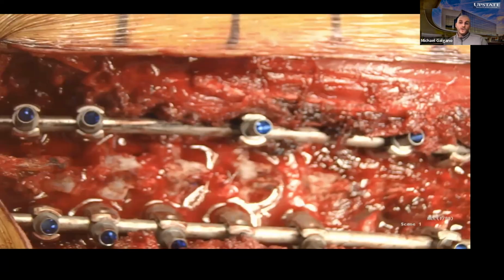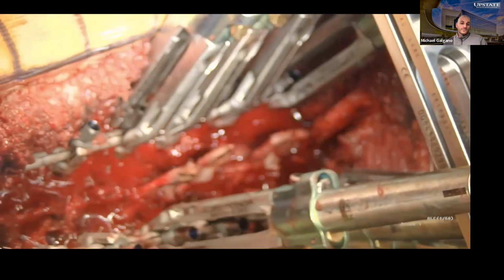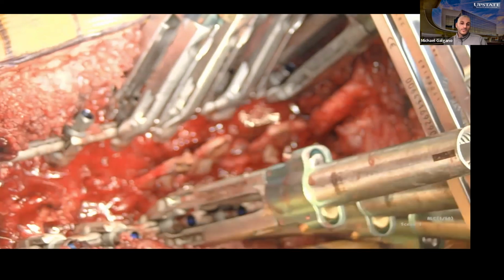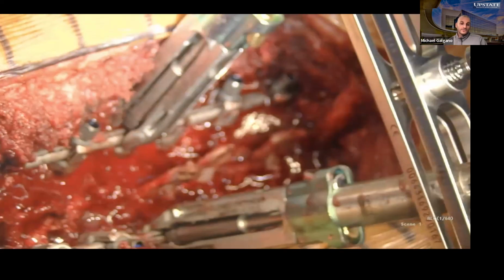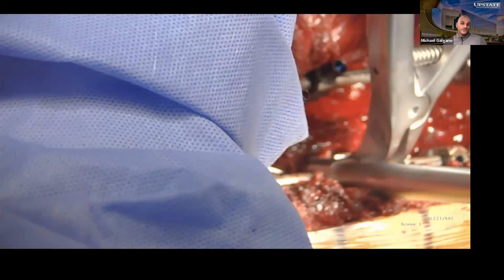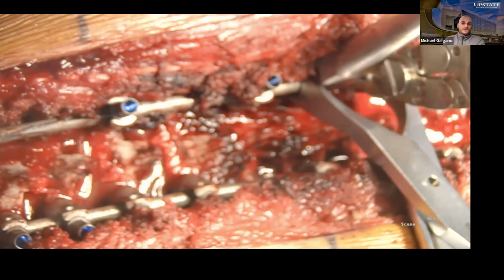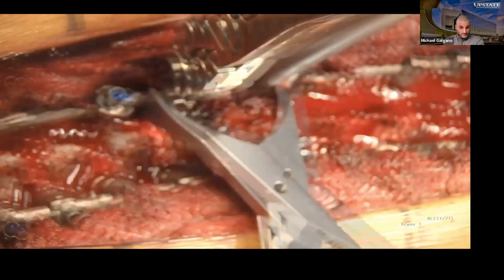And then after you do that, it's all about fine tuning, right? You put your derotators on. We did some en bloc derotation in the lumbar spine. We did a little bit of segmental derotation in the thoracic spine. And after we did that, a little bit more fine tuning with just some compression distraction. We compress across the convexities, distract across the concavities. And then this really just fine tunes things at the end of the case. And I think we had a pretty good result here.